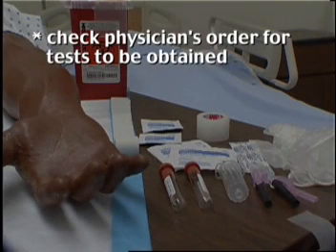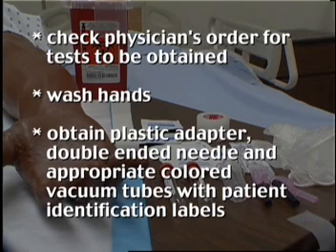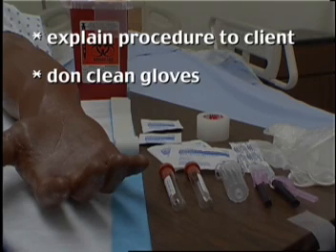Check physician's order for tests to be obtained. Wash hands. Obtain plastic adapter, double-ended needle, and appropriate colored vacuum tubes with patient identification labels. Explain procedure to client. Don clean gloves.